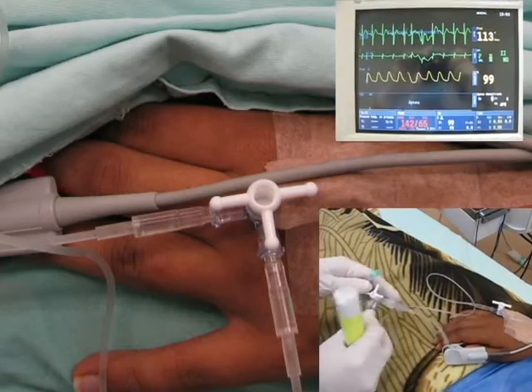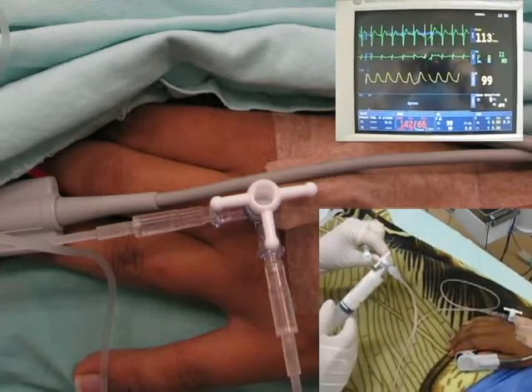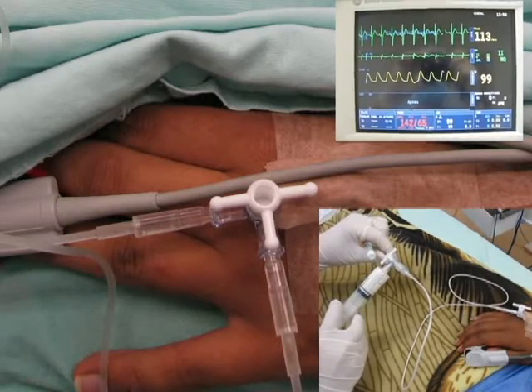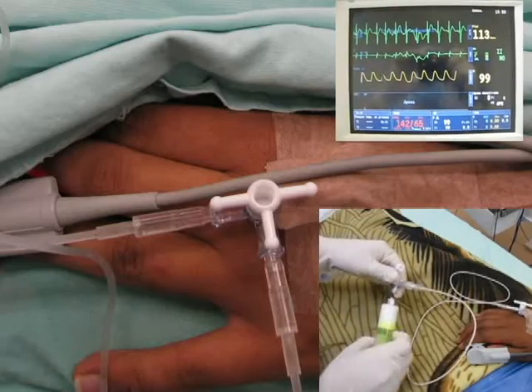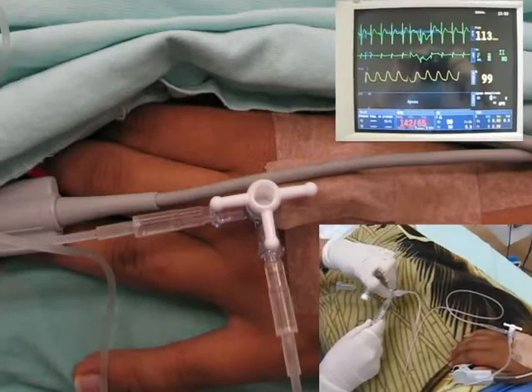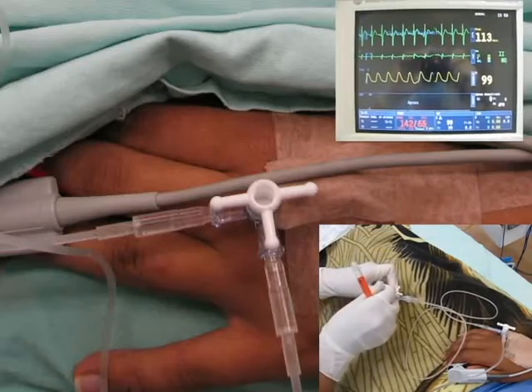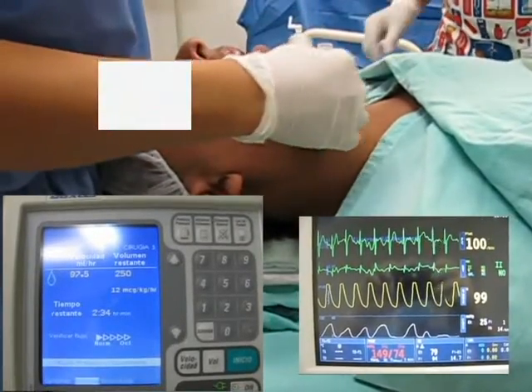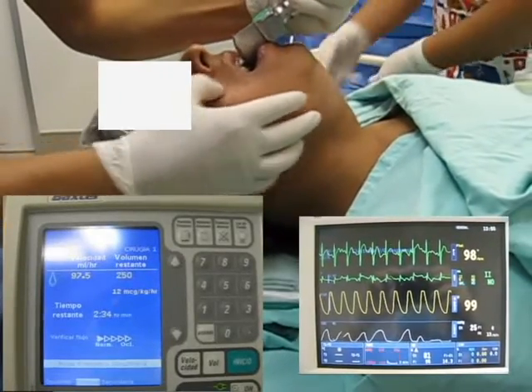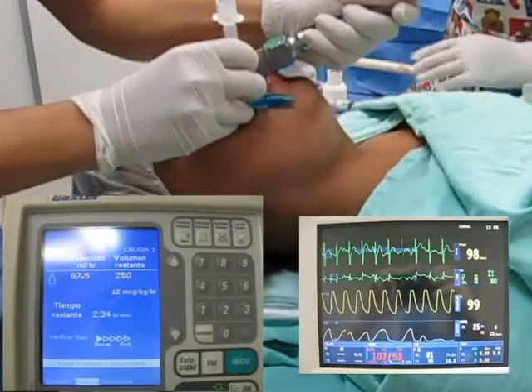After 3 minutes have passed from the start of remifentanyl infusion, 200 milligrams of propofol are administered — that is 2.9 milligrams per kilogram. When propofol is administered after 3 minutes of remifentanyl infusion, the lidocaine dose is not necessary since the injection is painless. When 2 minutes remain of remifentanyl infusion, between 1 and 1.5 ED95 of neuromuscular relaxant is administered — in this case 30 milligrams of rocuronium. After 6 minutes of remifentanyl infusion and the complete dose of propofol, and 1 minute after rocuronium, the patient can be intubated with a probability of no response of 95% and excellent intubation conditions.